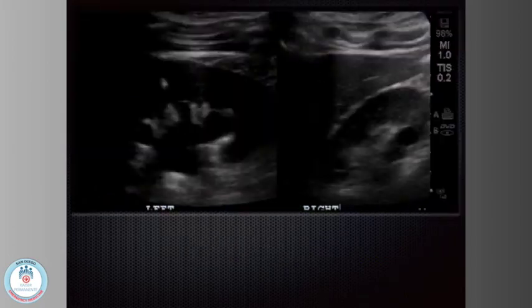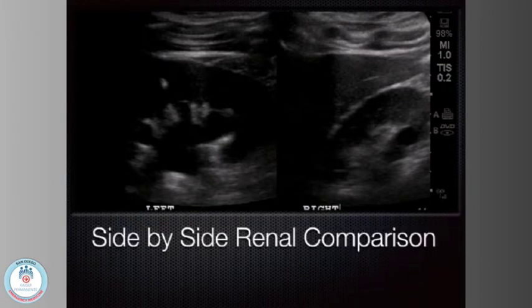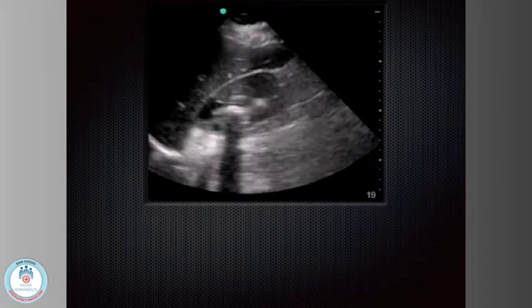This patient went straight to the operating room based on that ultrasound. And this is what I'll do: I'll compare the kidney. So you can split the screen. You hit dual screen or split screen, and if you wanted to compare the kidneys, I do this a lot when I'm showing something to the patient or to the consultant. The hydro is on the left. That's what a normal kidney should look like there.